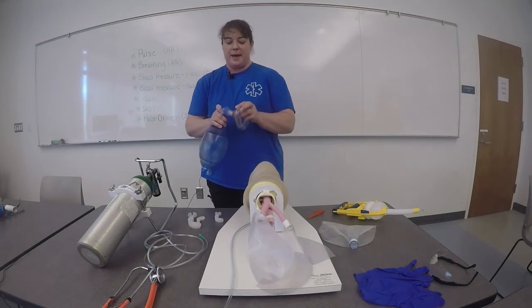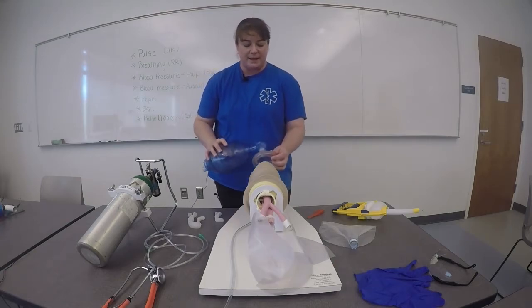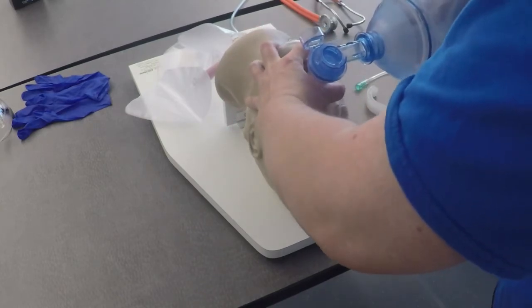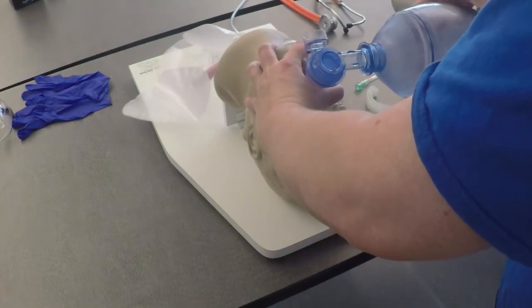I'll then prepare my bag and my mask, get a proper mask-to-face seal, and begin ventilation of one breath every five to six seconds, watching for chest rise and fall.